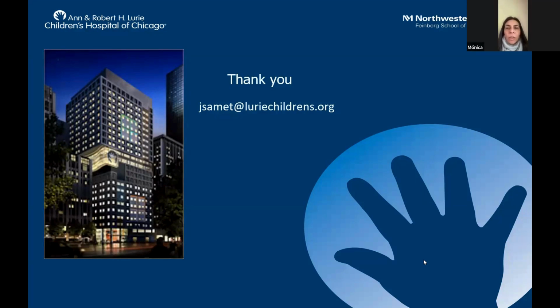Hi, Jonathan. Thank you for an excellent presentation. I want to ask you, do you use the same protocols in newborns? For younger than 18 months, we usually do a full MRI with contrast. They might do a feed and swaddle examination, but because of the issue with the unossified bone, we do still give contrast. So we don't do the rapid for newborns.